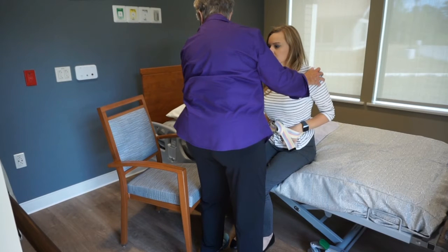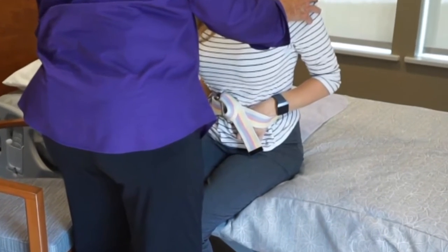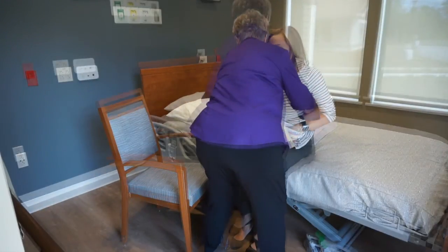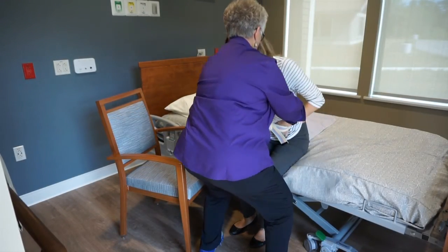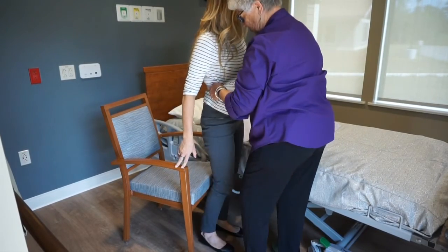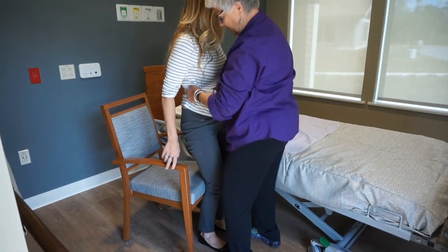If the person has a weak arm that is unable to assist in the transfer process, tuck the hand of the weak arm into the gait belt. Reach between the person's arm and shoulder to grasp the gait belt for the transfer, prompting the person to use his or her strong arm when reaching for the chair or wheelchair.